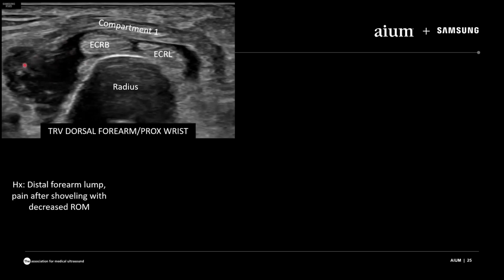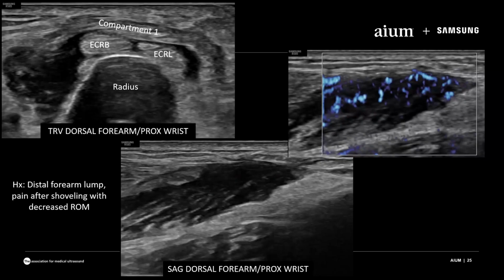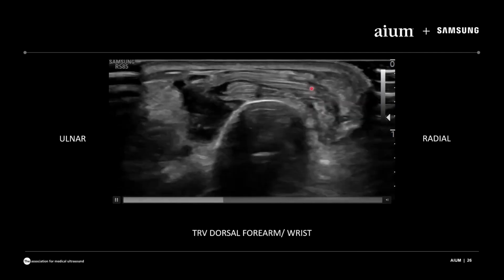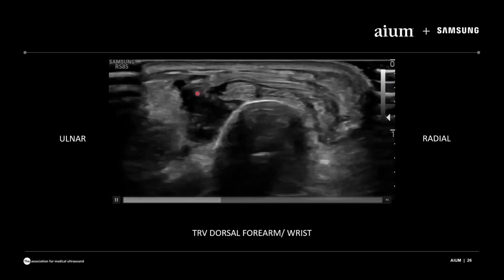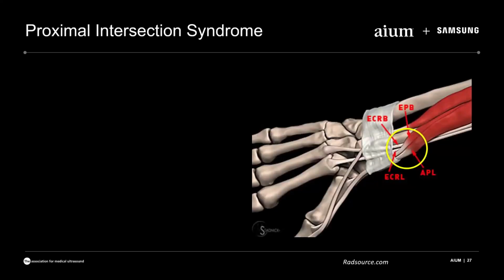And the muscle here looks a little edematous and hypoechoic. When we turn on long axis in this area, you can kind of see that hypoechoic heterogeneity at the myotendinous junction. When we add MV flow, it's very hyperemic. And then let's look at this in real time. So again, there's the ulnar side, radial side. Here's the radius, compartment 2, and then compartment 1 is crossing over. So as we move proximal to distal, look how thick that compartment 1 tendon is. We're seeing fluid around compartment 2, and that indicates that there's this proximal tenosynovitis, along with this edema here at the myotendinous junction. So this is an example of proximal intersection syndrome.